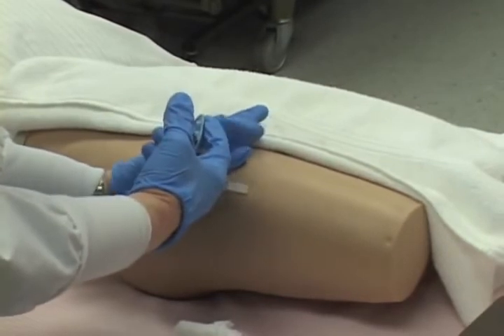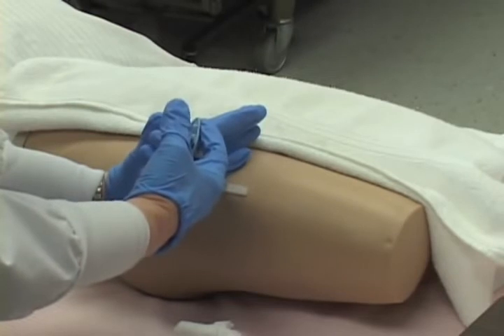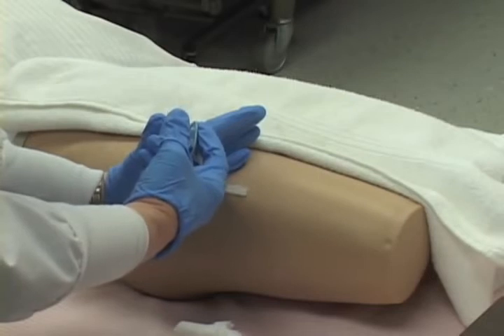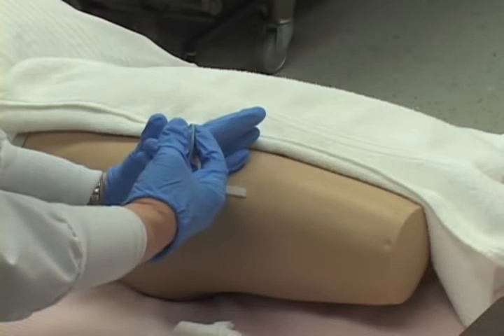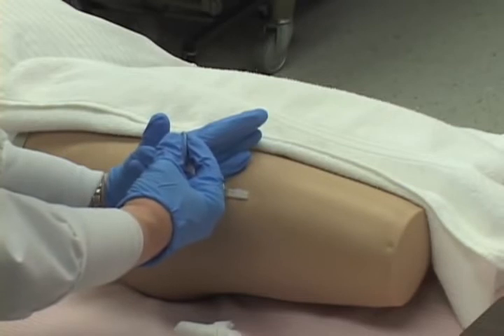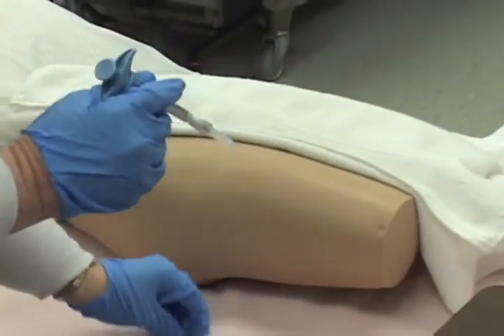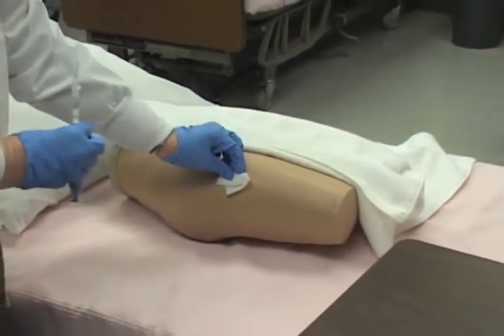If blood is aspirated, withdraw the needle from the tissue and discard the syringe and prepare the medication in a new syringe. If no blood is aspirated, inject your solution slowly. Hold the needle in place for approximately 10 seconds to allow the medication to diffuse through the muscle. Then quickly withdraw the needle. Then lift your non-dominant hand to release the displaced tissue, allowing the tissue to return to its normal position.